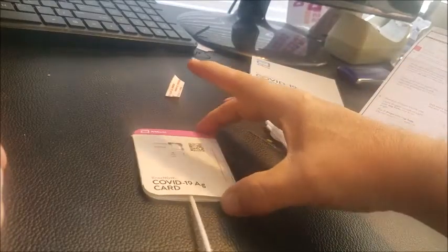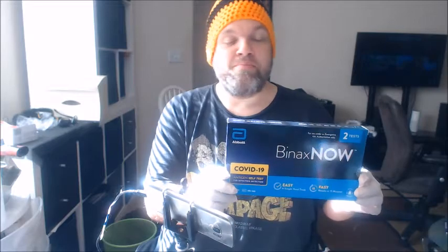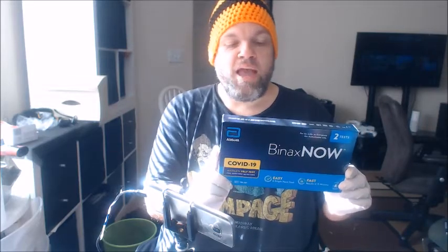And as you can see here, I got two pinkish-purple lines. Greetings. I want to be taking a test with the Abbott Binax Now Antigen Self-Test, and I want to show you exactly what I'm doing to test myself to see if I have COVID.